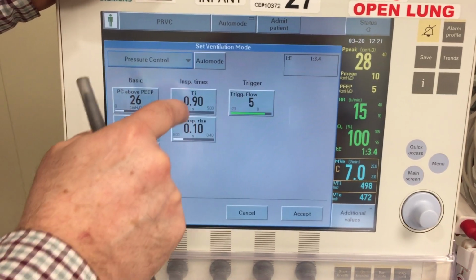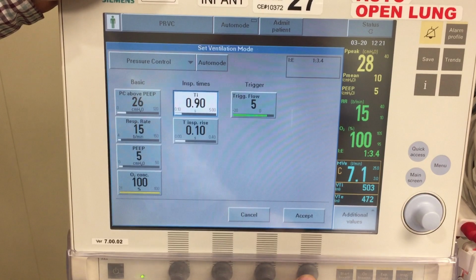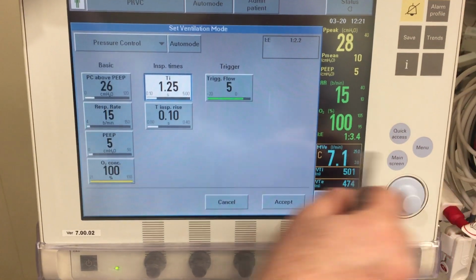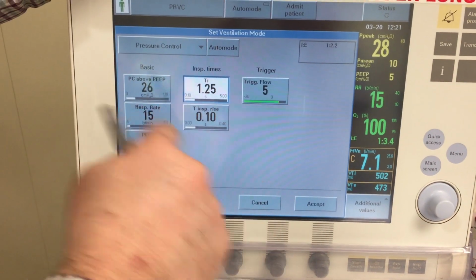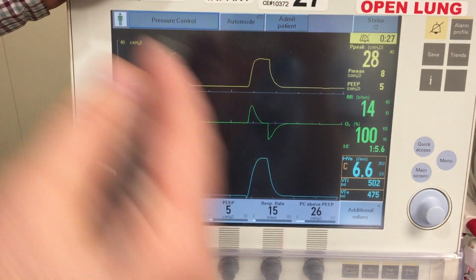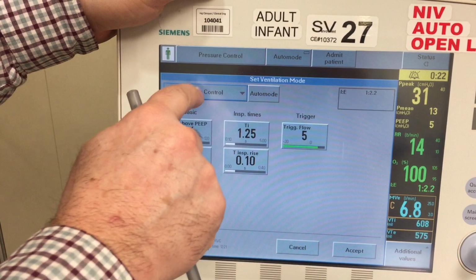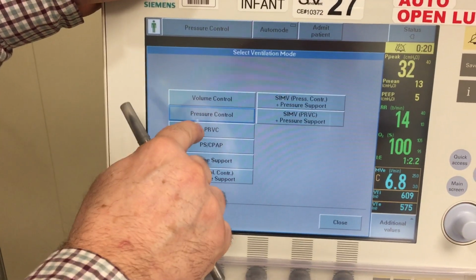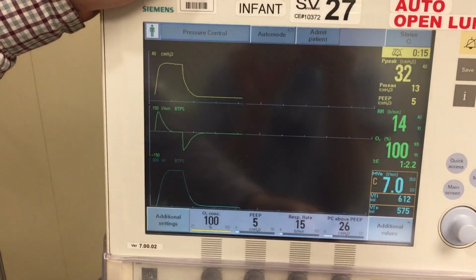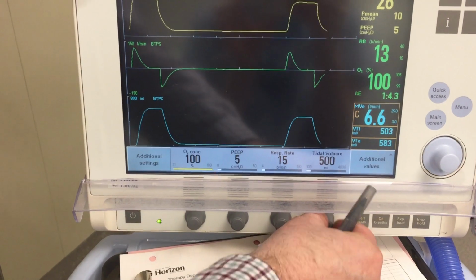To show you, if I want to increase the I time on pressure control mode, I would just highlight it, turn the button here, and say I want an I time of 1.25 seconds and hit accept. Okay, and that's basically how we activate things. Right now we're in pressure control mode because I accepted it, but you can also cancel it. What we'll do is accept this mode here, back to PRVC, and go back to our initial settings.